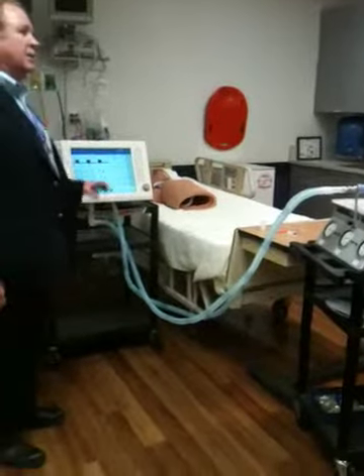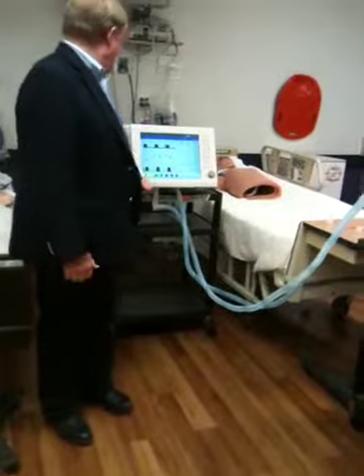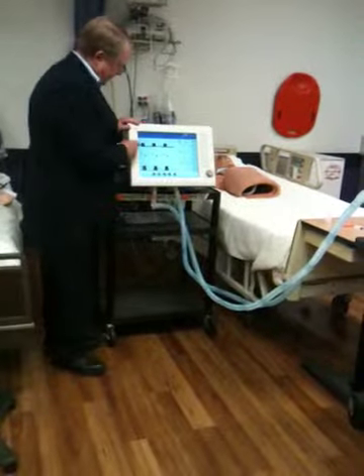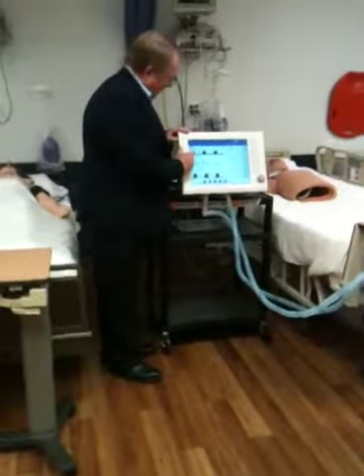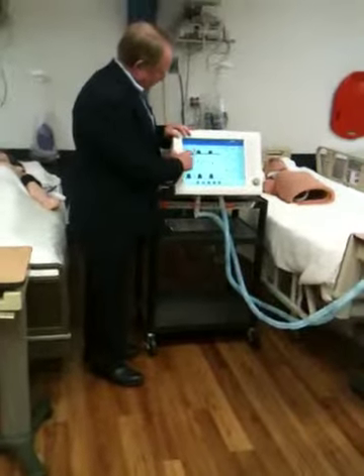So the graphics are nice to look and say, okay, I need to look closer because that's what's changed. For instance, when we talk about PEEP, you notice the pressure here comes up, holds for the breath, comes down, but it doesn't come down to 0. And that is my PEEP level all the way across. When we talk about PEEP, that's what it is.